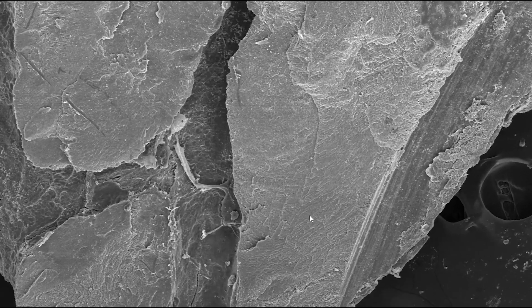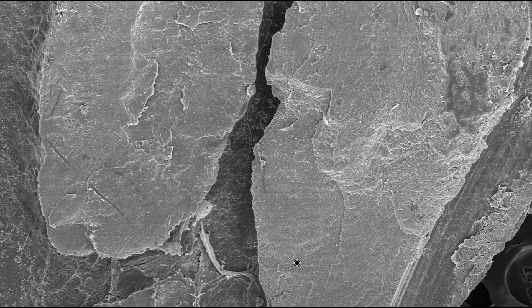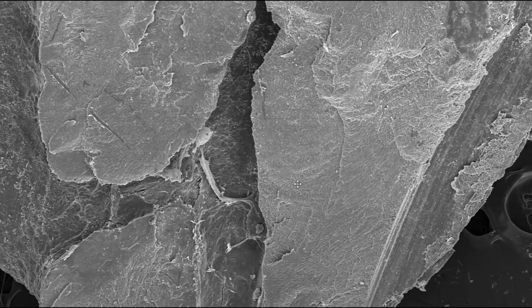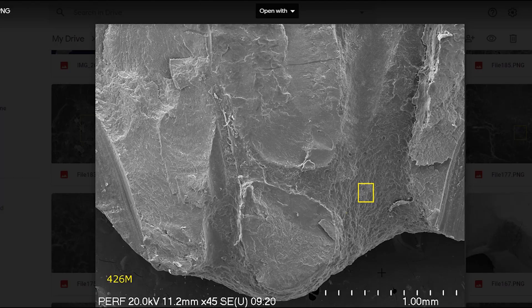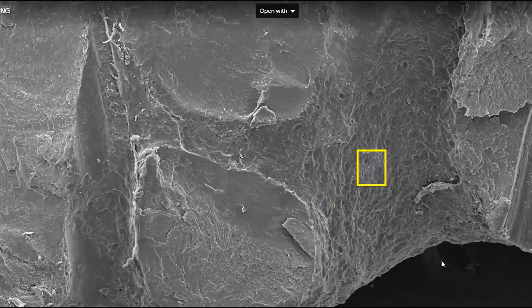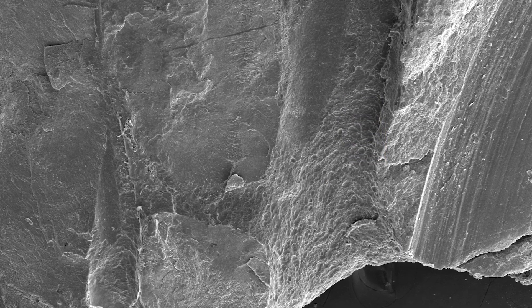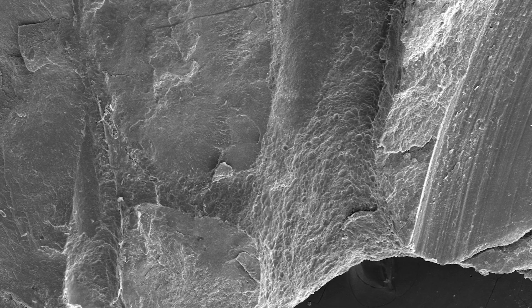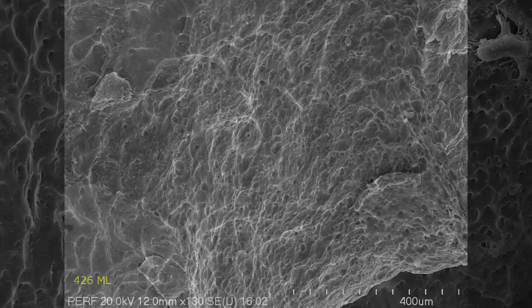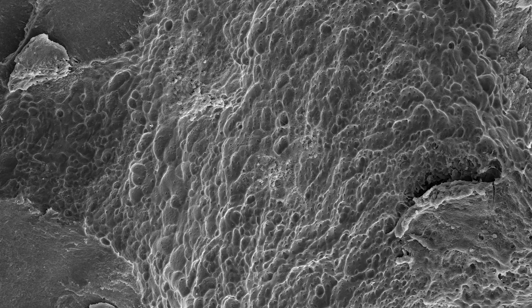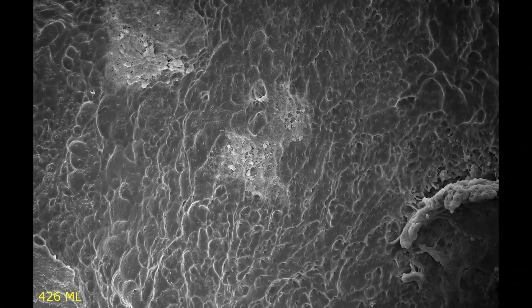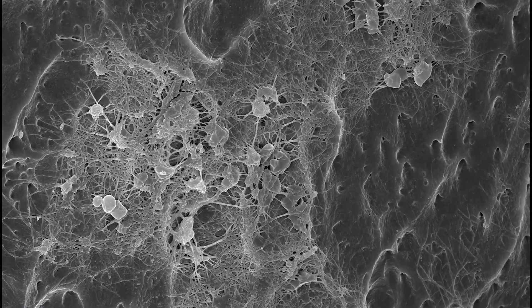Looking at the mesiolingual canal, we see a very similar picture. There is basically no organic debris and no bacterial contamination at all. Here is the business end of the mesiolingual canal, and you can see it is actually exceptionally clean. There you can see some of the dentinal tubules. So even in the apical end of the root, the activity of the GentleWave seems very significant.